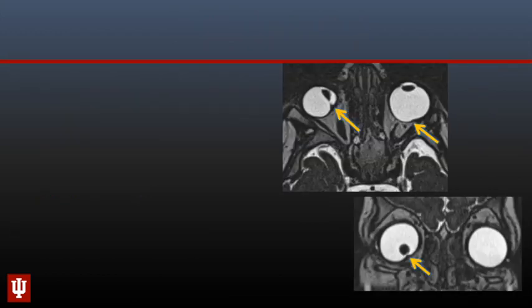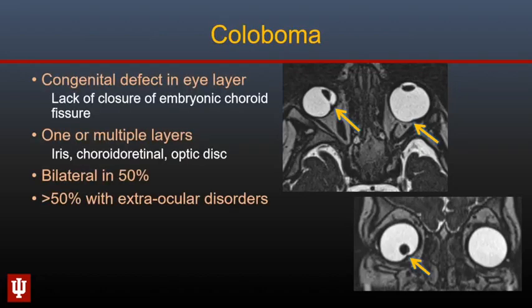Here is an infant with dysplastic appearance of both globes with fissuring along the inferomedial and posterior aspect — this is described with coloboma, a congenital defect in any layer of the eye occurring because of absence of closure of the embryonic choroidal fissures. They may be bilateral in about half the cases and are frequently associated with intracranial or systemic malformations. Staphyloma should be differentiated from coloboma — it occurs because of thinning of a globe layer and is an acquired condition.